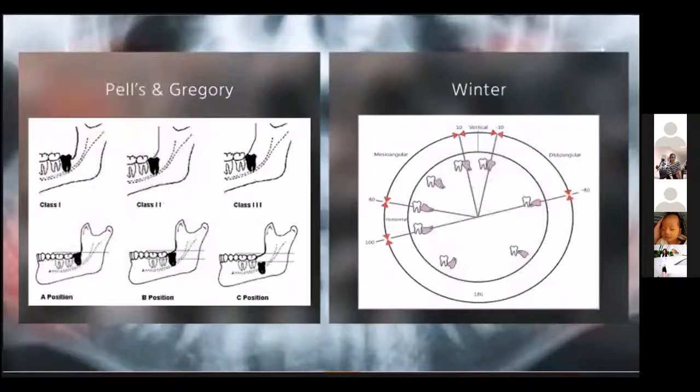Traditionally, radiographic images of impacted mandibular third molar have been commonly categorized based on position in terms of depth and ramus relationship, as in the Pell and Gregory classification system, and inclination, as in the Winter classification system, for evaluation of removal hardship.